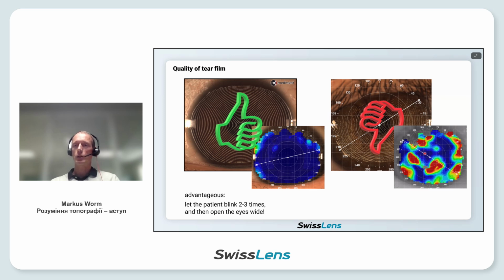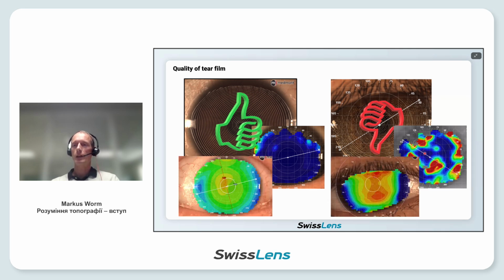Ensure that the patient opens his eye as large as possible to catch a large surface of the cornea. Also here, a very good example on the left side, a bad one on the right side, where the upper eyelid covers too much of the cornea.